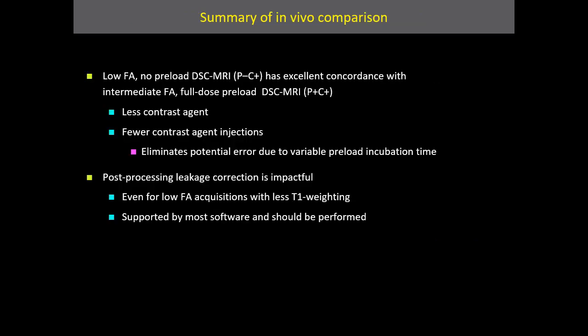And so we concluded from this comparison that a low flip angle, no preload DSC has excellent concordance with an intermediate flip angle full dose preload protocol, it requires less contrast agent and fewer contrast agent injections. And we also conclude that post-processing leakage correction is still impactful even for low flip angle acquisitions with less T1 weighting.